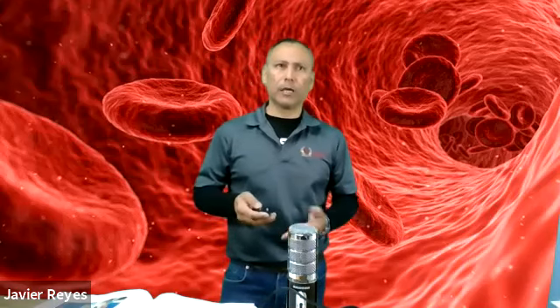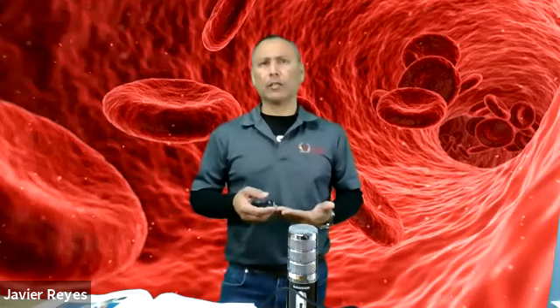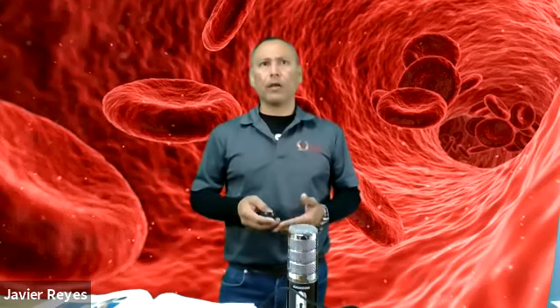Now this specimen requires special handling, so you have to be familiarized with this handling process, which usually includes placing these collection tubes in ice slurry, not ice cubes, not ice water, but ice slurry, because you want these specimens to be not frozen, but very cold to minimize the amount of oxygen that is being used by the cells in the blood. Okay, so again, capillary blood gas equipment is not used too often, but you have to be familiar with it. We're going to be working with microscope slides.